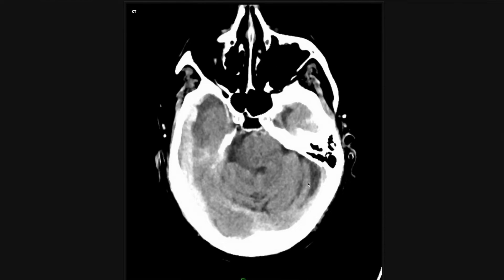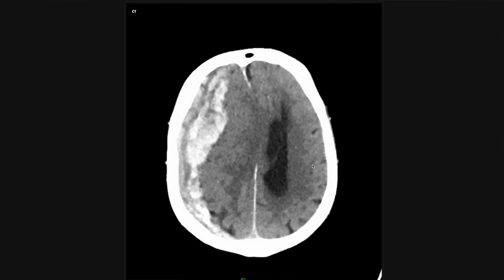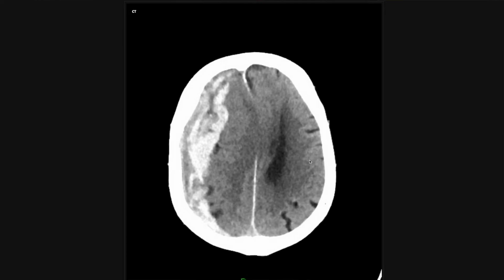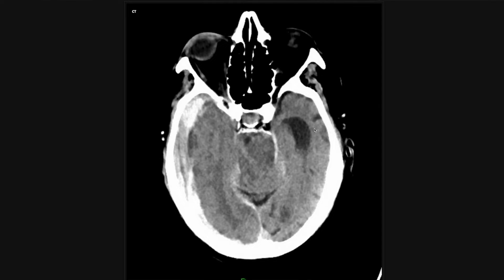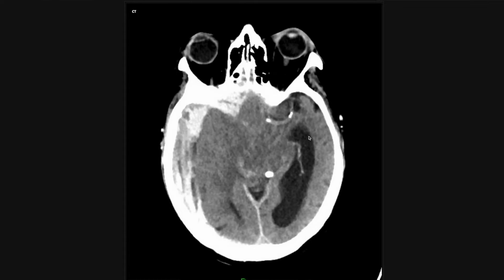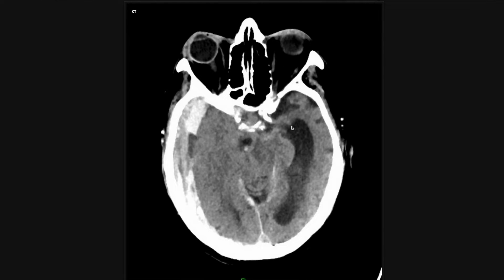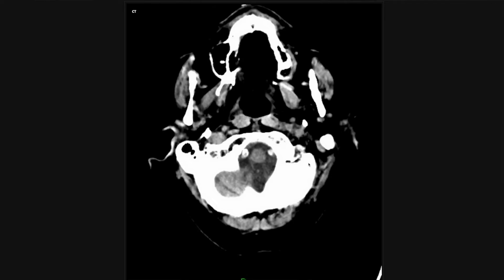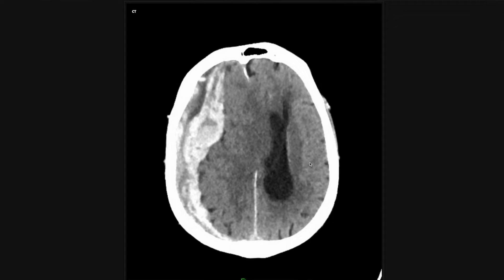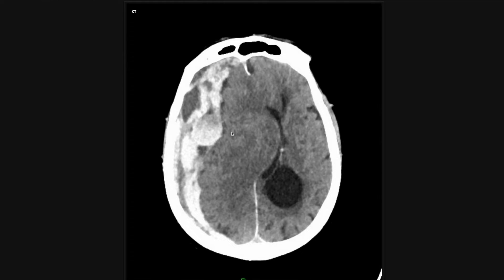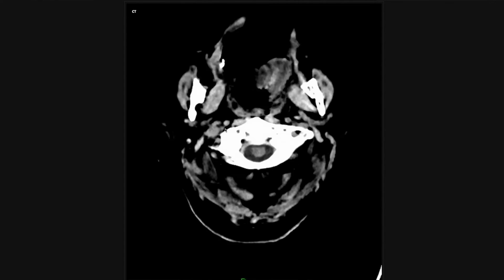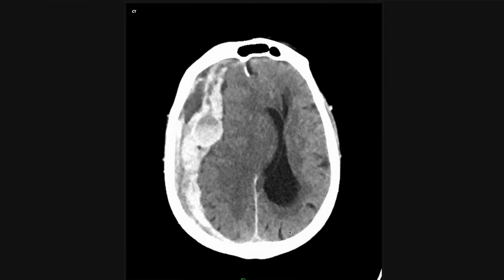One other thing to think about is ventricular entrapment. When you have midline shift like this, the ventricular system can be obstructed. As we see here, the left lateral ventricle is very dilated — the temporal horn of the left lateral ventricle is very dilated because this ventricle is basically entrapped and flow of CSF is obstructed. You have resultant obstructive hydrocephalus from the mass effect of this midline shift. This can happen if you were to miss a smaller subdural, let the patient go home and continue anticoagulation, and then have worsening hemorrhage leading to midline shift and obstructive hydrocephalus.